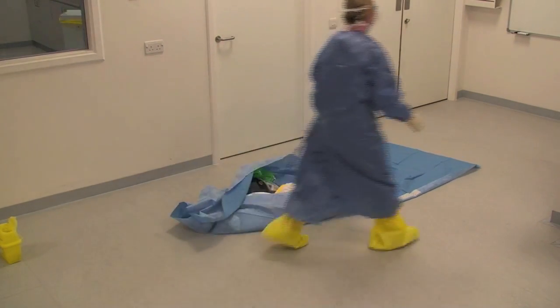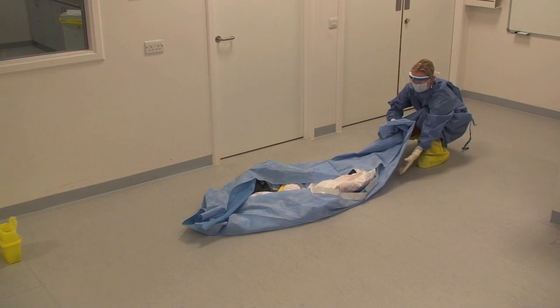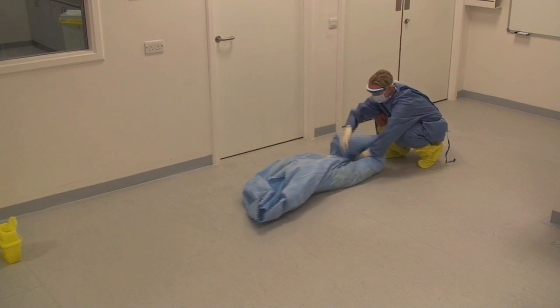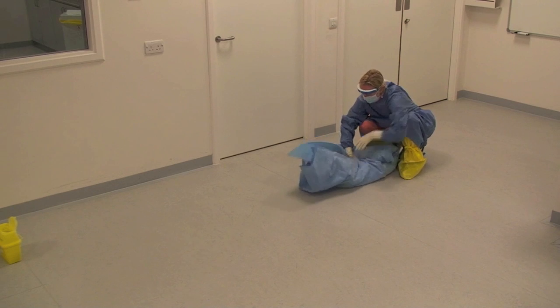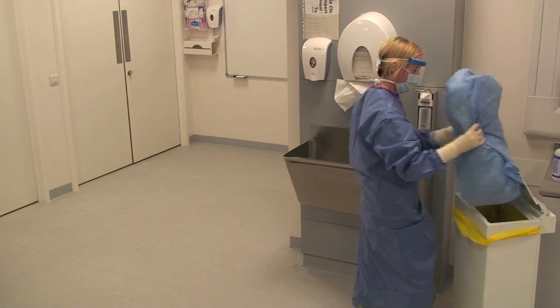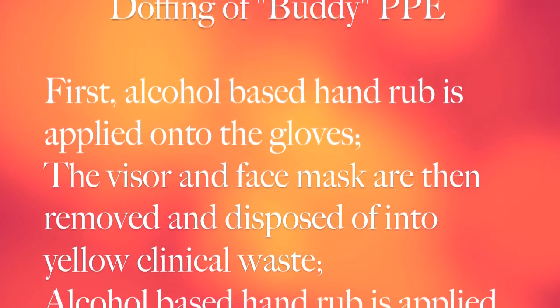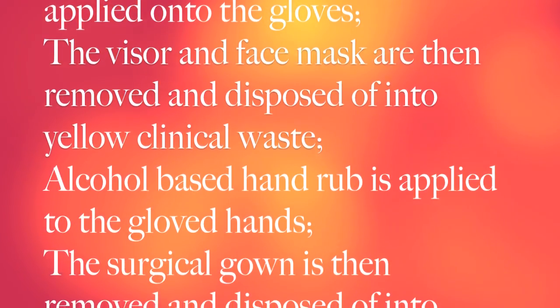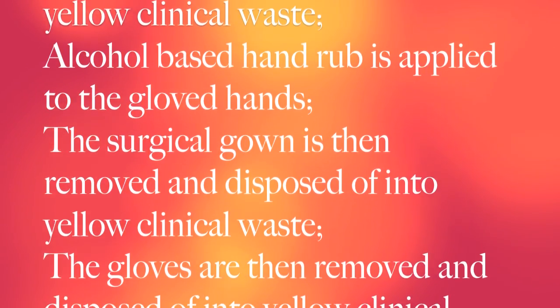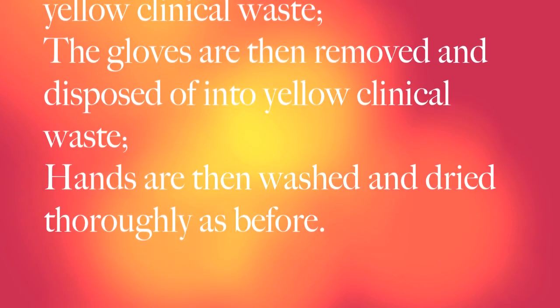The buddy then carefully folds the blue sheet into itself ensuring the contents do not spill onto the floor. The package is then disposed of into a yellow bag as clinical waste.